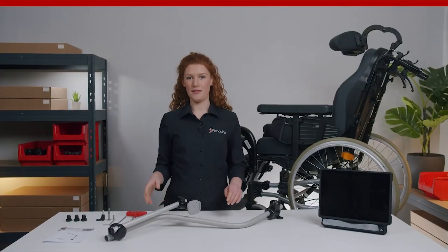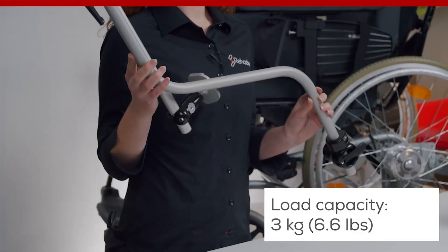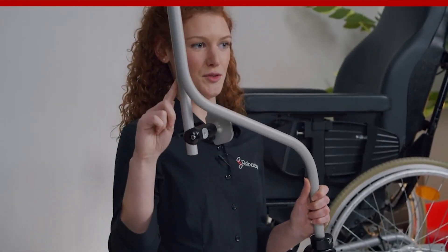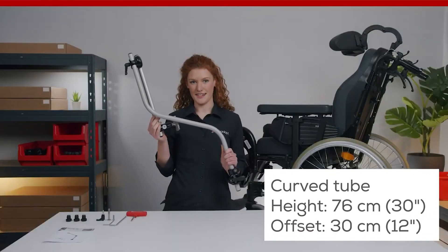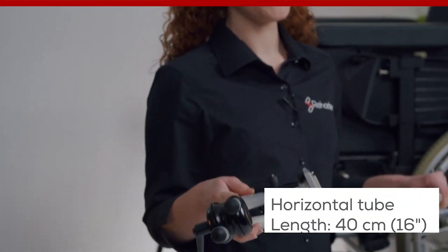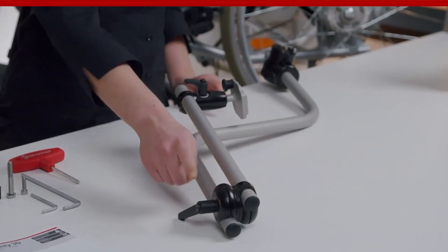Today we focus on the M3D curved L mount which has a load capacity of 3 kg. This two tube construction consists of a curved tube and a horizontal tube. The curved tube is 76 cm high and has a 30 cm offset. Like most M3D mounts, the horizontal tube is 40 cm long.